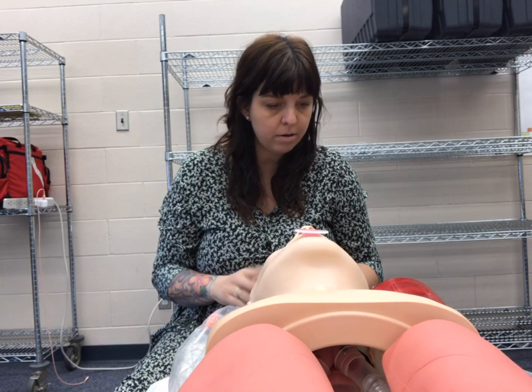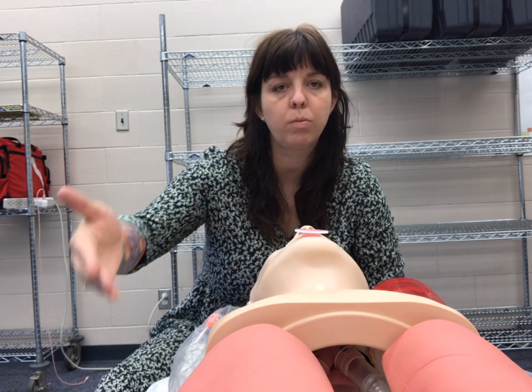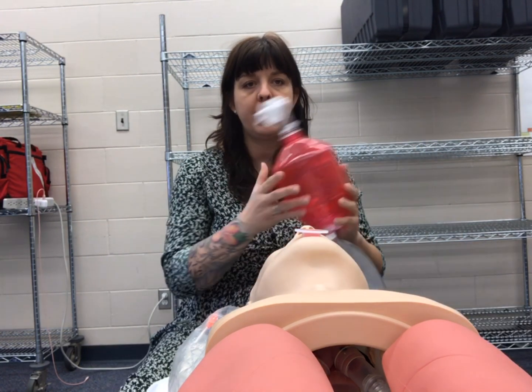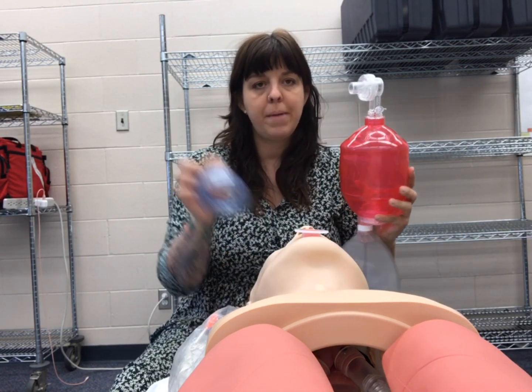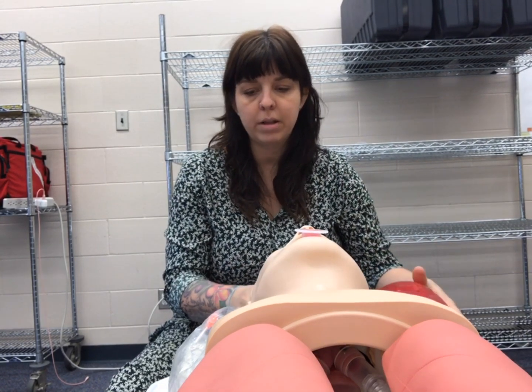I assess his rate, depth, and quality of breathing and find he's breathing at a rate of two — regular but shallow. That's not enough to sustain life, so I'm going to take out a BVM. I need to set up several things with it, so let's go through that quickly.